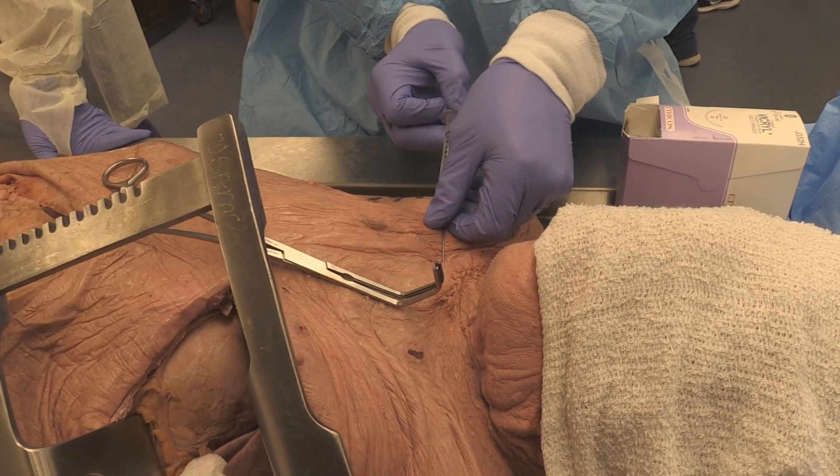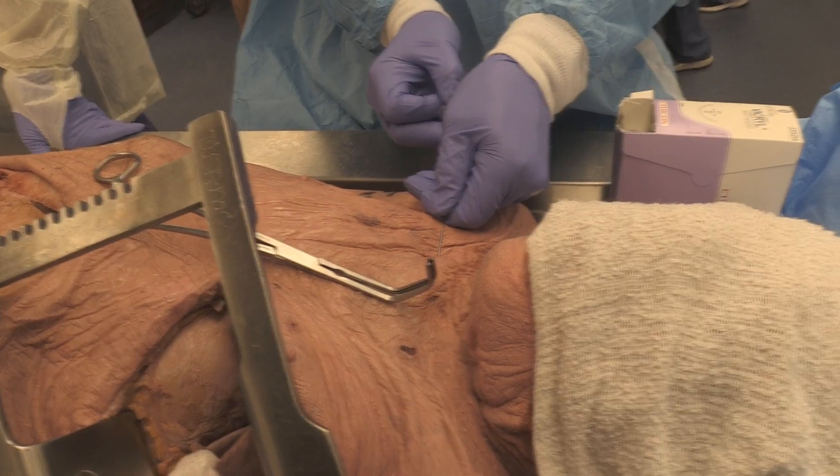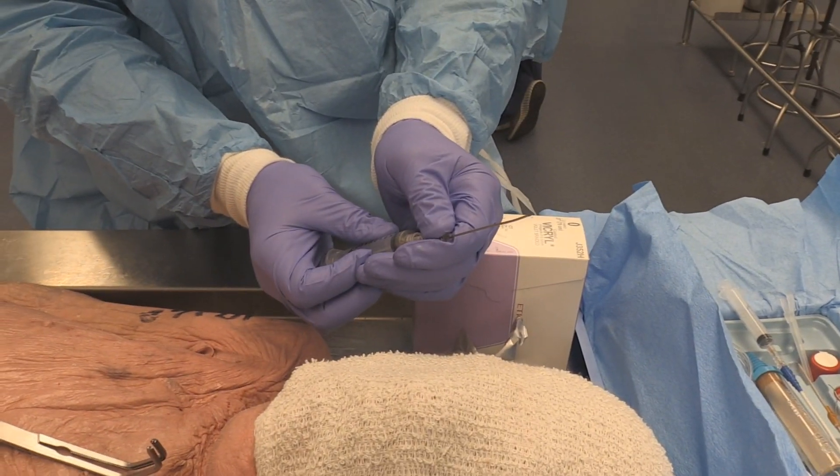As soon as you make that right-hand turn, aspirating on the syringe — boom — you're in the vessel. As soon as you make the right-hand turn. I line my bevel up with the numbers so I'll know at all times where my bevel is.